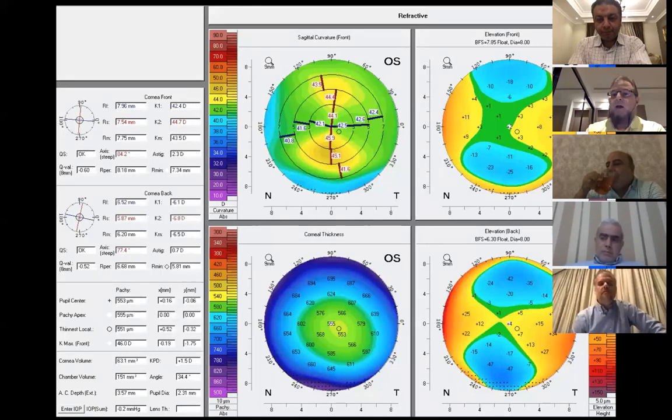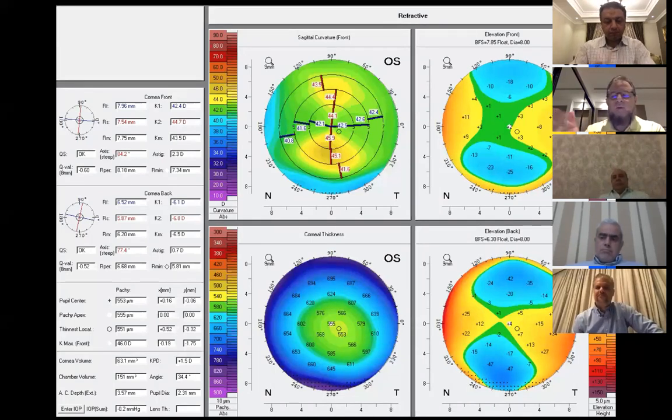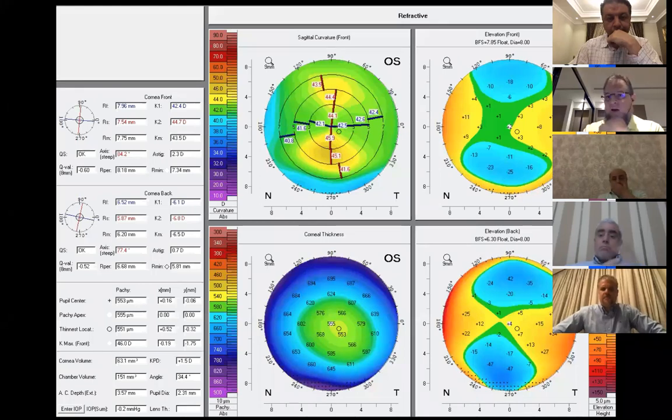Yeah, exactly. Actually, studying the aberrometry, the corneal aberrometry of the patient, in my view, is mandatory for every patient. It's very, very important, because in many cases we find very few irregularities. We may miss such irregularities, while the patient may have a coma, may have spherical aberration, and this may change the plan of treatment. Instead of going for the optimized, we may go for, for example, wavefront guided or topography guided.